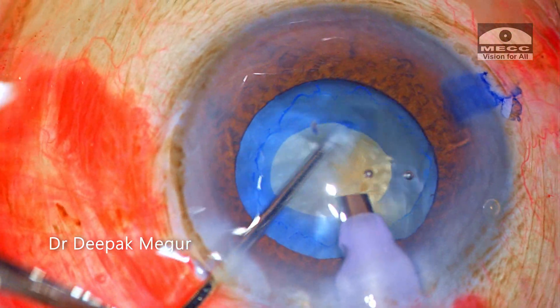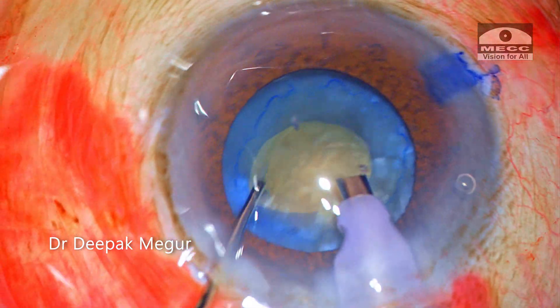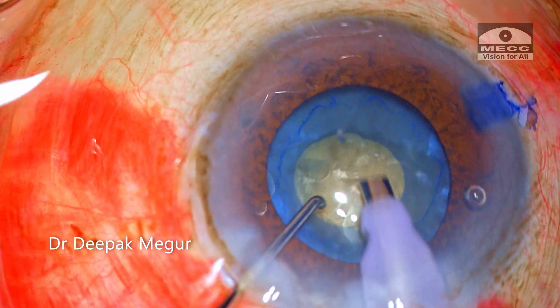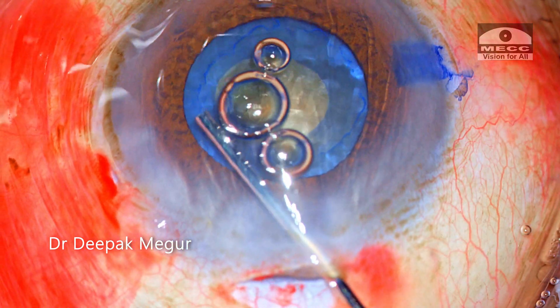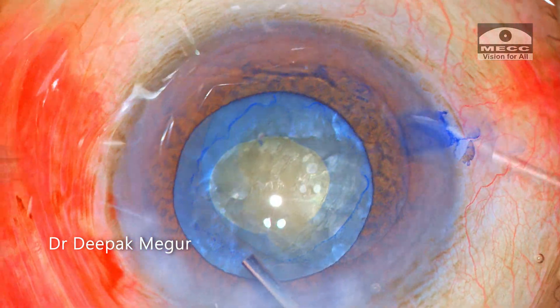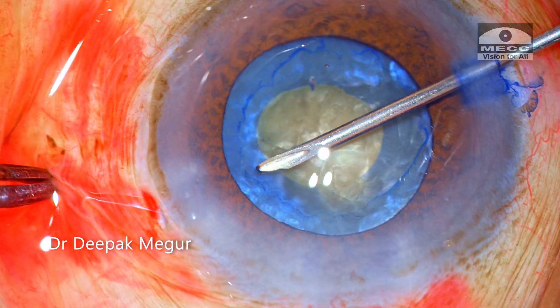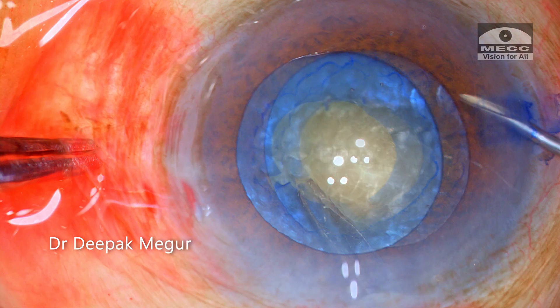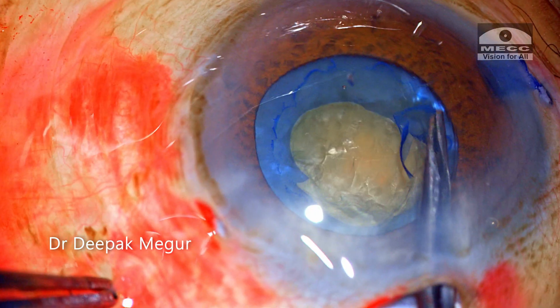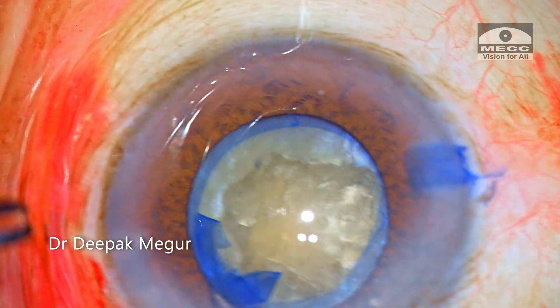Using the second instrument to rotate the nucleus and mobilize the cortex is necessary since we cannot go in with the phaco probe directly under the small rhexis opening toward the peripheral part. Once I am convinced that the bag is decompressed well enough, I proceed to rhexis enlargement. Since I do not have access to micro scissors at this point, I am using a needle to nick the rhexis margin and raise a flap. I then use forceps to hold the flap and tear it in a controlled manner to achieve a rhexis of a decent size.